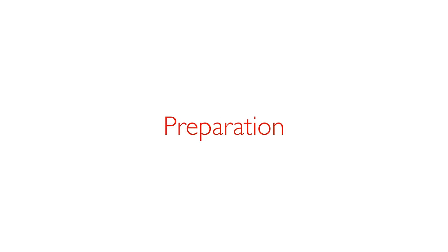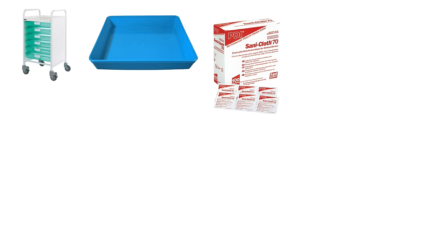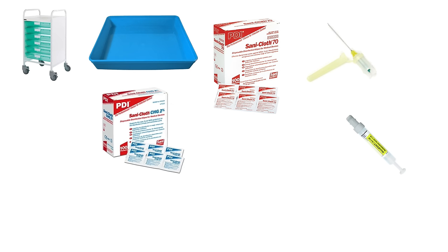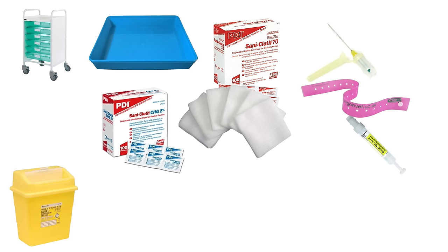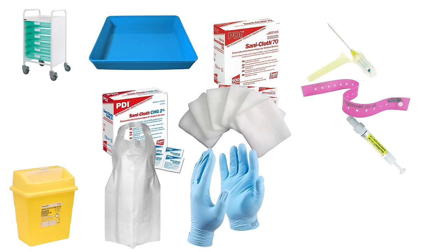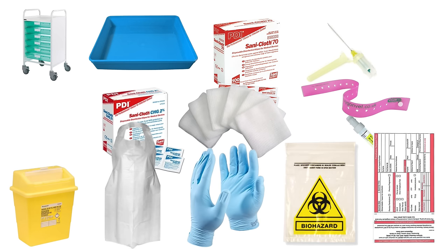In the preparation area gather the equipment. You will need a trolley, a tray, something to clean them with, a needle system, blood sample bottles of the appropriate type, something to clean the skin with, gauze, disposable tourniquet, a sharps bin, an apron, a pair of non-sterile disposable gloves, hazard bags and blood request forms.